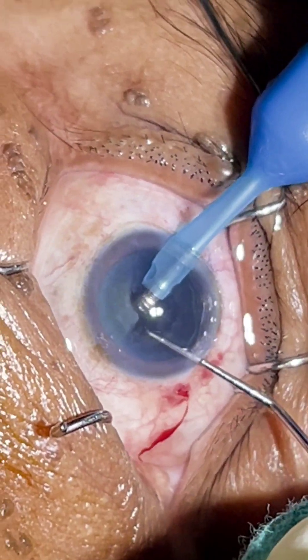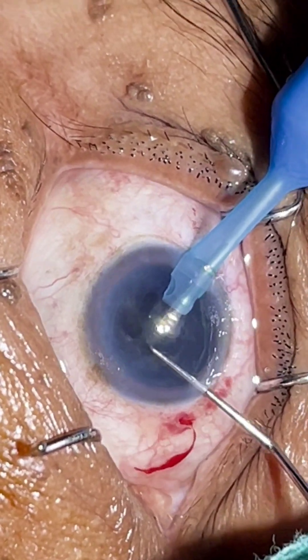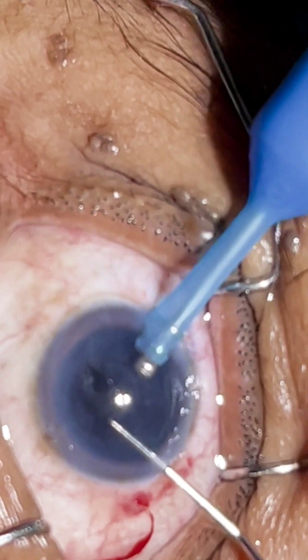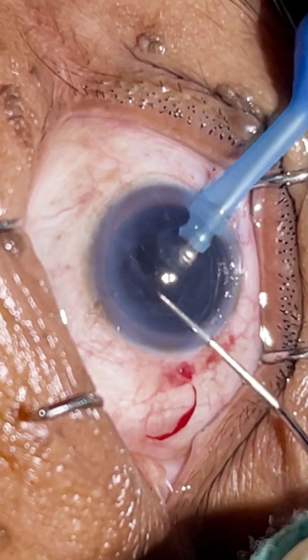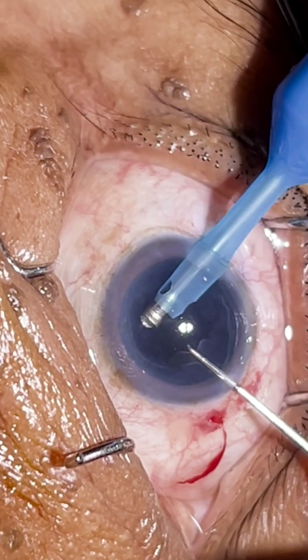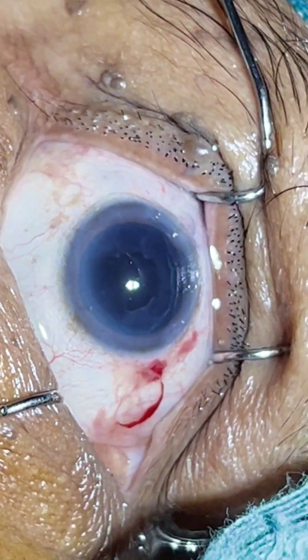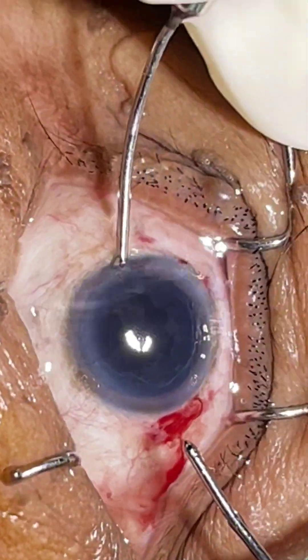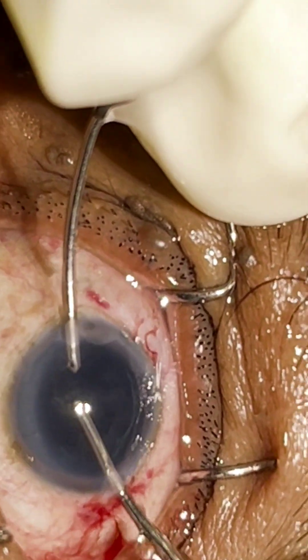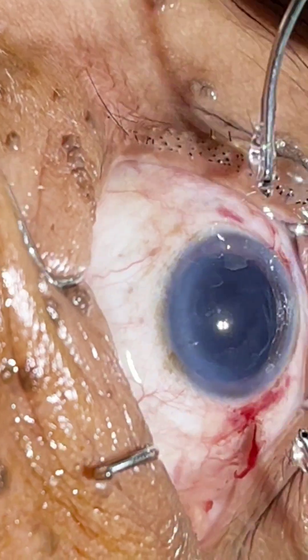One hemi-nucleus is already emulsified. As it is a topical case, the patient is blinking occasionally, so we have to fix the eye. We are done with the nucleus; now we will try to remove it with the phaco tip, as much as I can remove. The cortex also I am trying to remove a bit with the phaco tip itself. Now we will proceed with bi-manual irrigation and aspiration. The inferior part of the cortex I have aspirated with the phaco tip itself; only sub-incision cortex is there. I am trying to remove that out thoroughly.